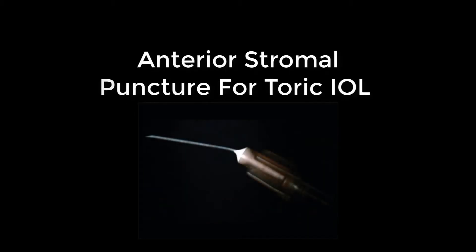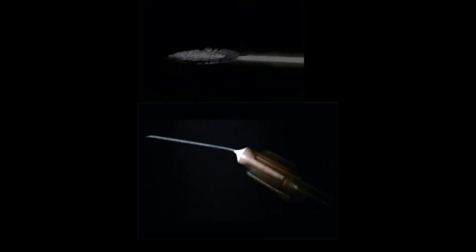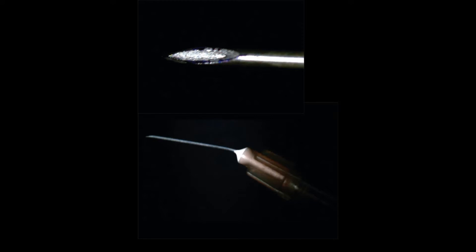Anterior stromal puncture for toric IOL. Errors can occur while marking, associated with smudging or fading away of dye during preoperative reference axis marking. Anterior stromal puncture creates a point mark without any epithelial erosion, and the simultaneous staining helps in perfect and long-time retention of the dye.